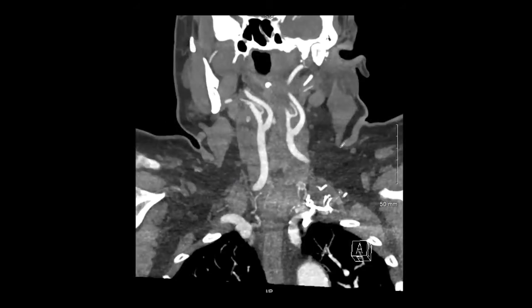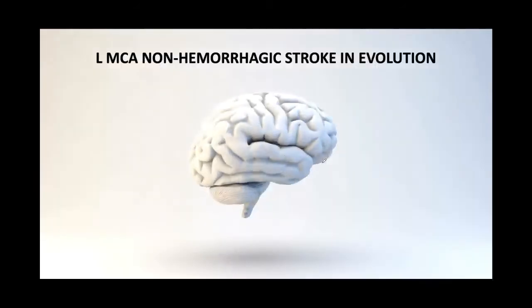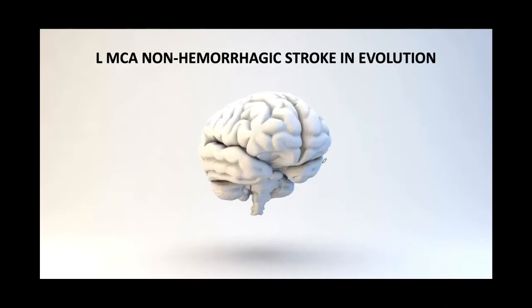On CTA, the internal carotid arteries look widely patent. On two-day follow-up, there is no hemorrhage, but the stroke that was invisible on the initial CT is now beginning to evolve — a hypodensity is now visible. This is a left MCA non-hemorrhagic stroke in evolution.